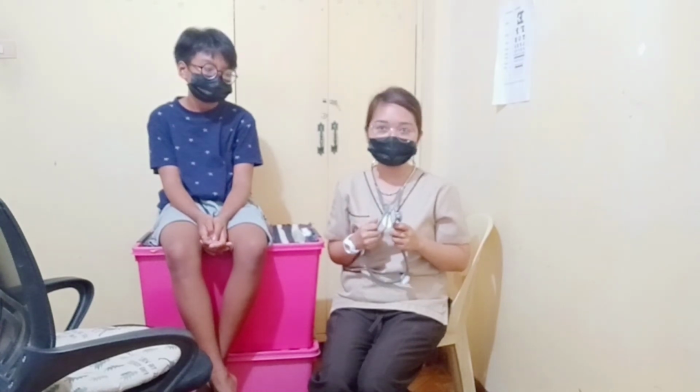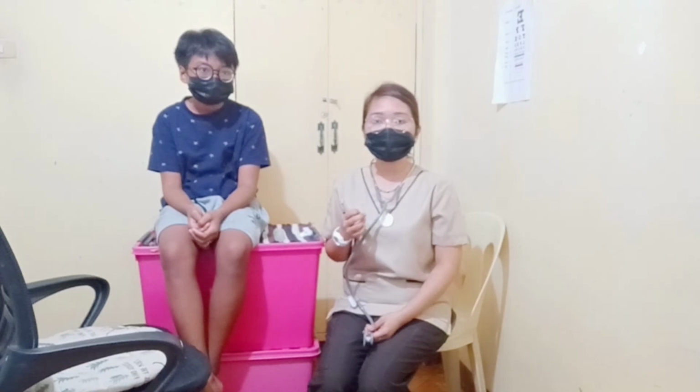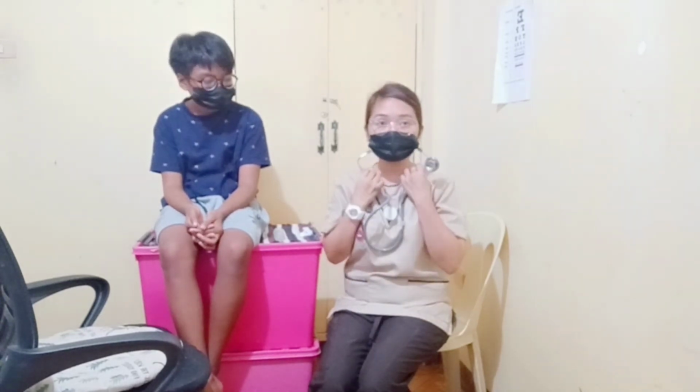Okay, so let's start. Now let's go ahead and auscultate the apical pulse of the patient. Same thing: if you notice that there's a regular pattern in terms of the heart rate, you can have it counted for 30 seconds and then just multiply it by 2. But if it's your first time to get the vital signs or the pulse rate of the patient, make sure you count it for 60 seconds, or if you notice an irregular pattern in terms of the pulse rate. Okay, so let me start.